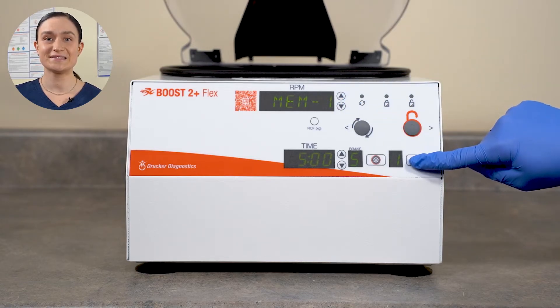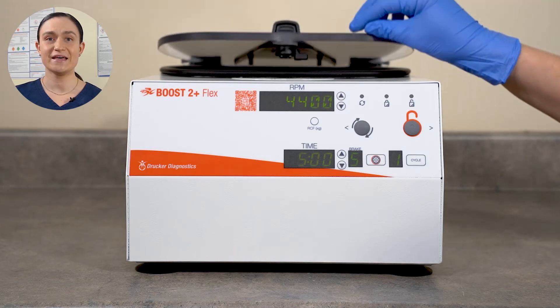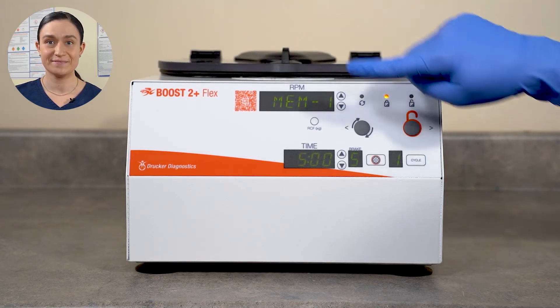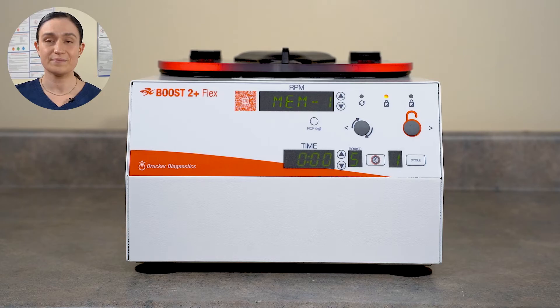All you can do is spin. Load the tubes, close and lock the lid, and then press the Start button. The centrifuge will start spinning faster until it reaches the specified RPM, and then spin for the specified time. Once your centrifuge finishes running, it will slow down, either applying the brake or not, as specified for that cycle. When it comes to a stop, the lid lights will flash and the centrifuge will beep to let you know it's done.